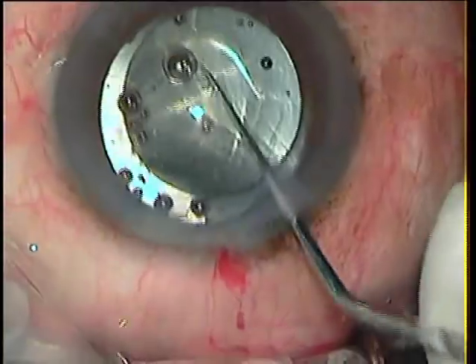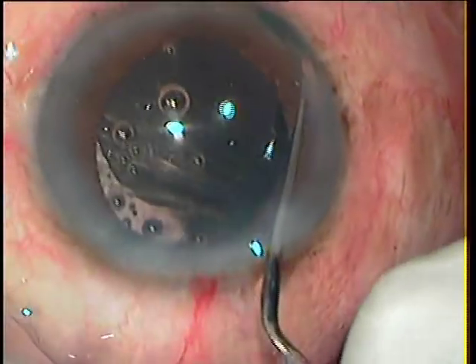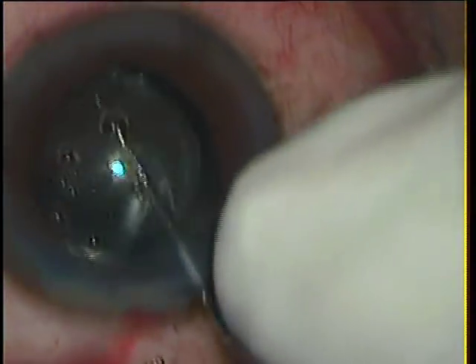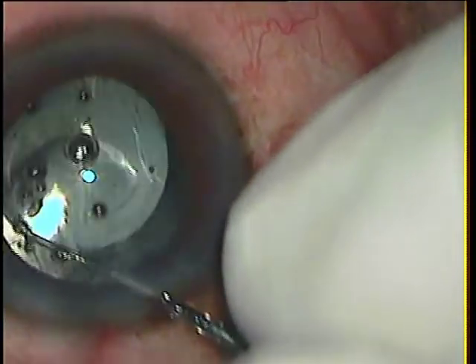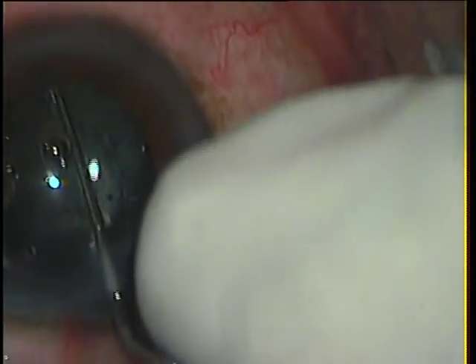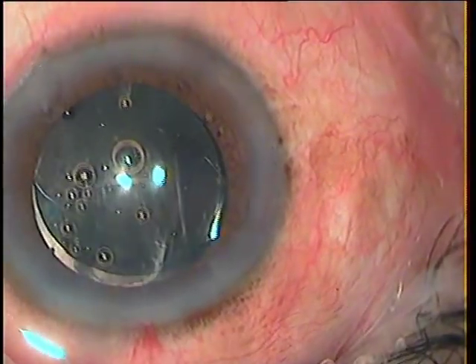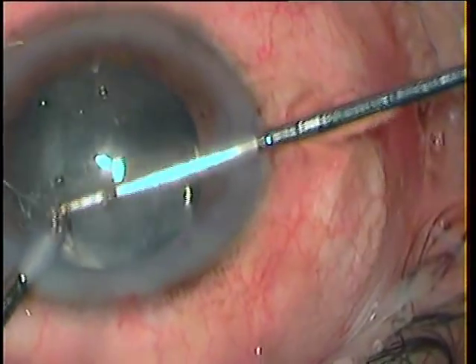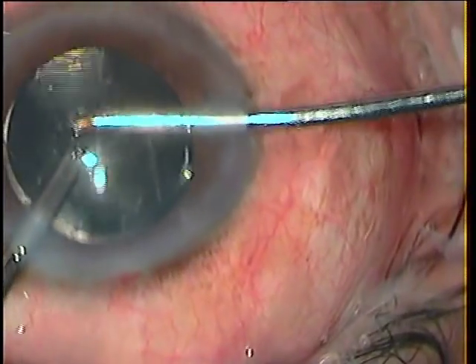One thing I have learnt is to inject the lens into the AC first. Earlier, in cases of posterior capsule rent, I would try to put the leading haptic at the designated place — either in the bag or in the sulcus — and quite often the lens would dip into the vitreous. So here I first inject the lens into the AC with both haptics above the iris. After injecting a bit of viscoelastic, I dial one haptic into the bag under the fornix, rotate the lens, and dial the trailing haptic under the fornix. I re-centre the lens and find it well-centred and properly in the bag.